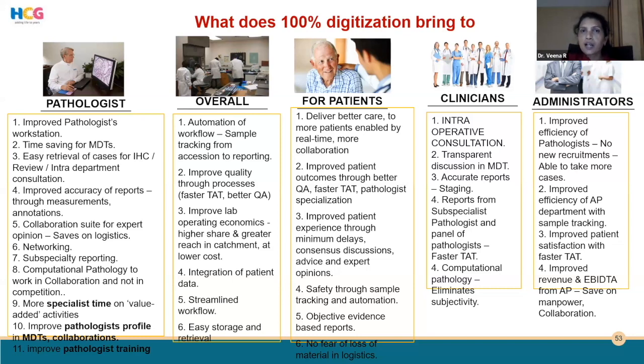That is better. And for patients, again, it's much more beneficial because they get much more accurate reports, and they get reports from the expert pathologists within a faster turnaround time. And in the laboratory, the workflow has definitely improved with much more traceability of the samples and archival of the slides, because we don't have to go back and search for the slides in the archive. We can easily pull out these images from the image management system if we have to correlate previous biopsies.